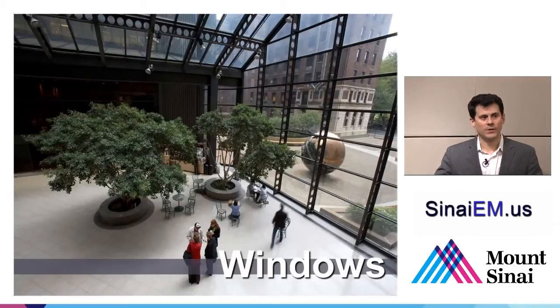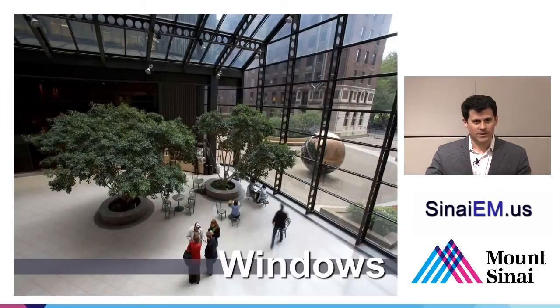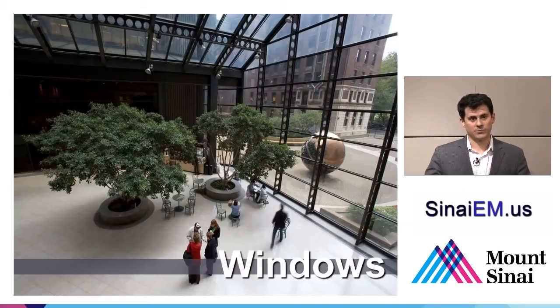So next thing we should talk about are windows. Ultrasound enthusiasts love to talk about windows. They always say get a good window, use the bladder as a window, don't use the lung as a window, and they don't really ever explain very well what is meant by a window. So let's take away sound for a moment, because it's a little difficult to understand what an acoustic window is. Let's think instead of other waves and think of light. So light travels through windows. So let's define windows as an area of a building where light passes through easily so that you can see stuff. So what we're going to try to do is find areas on the body that act with respect to sound the same way that windows act with respect to light.